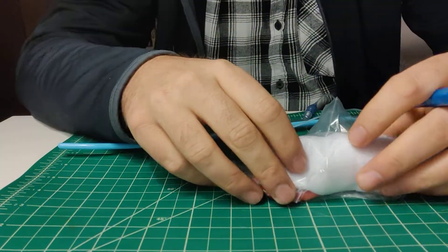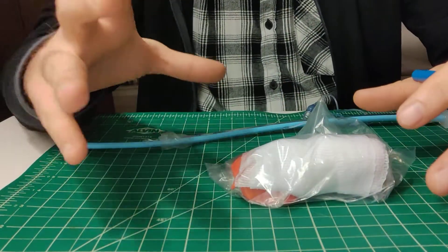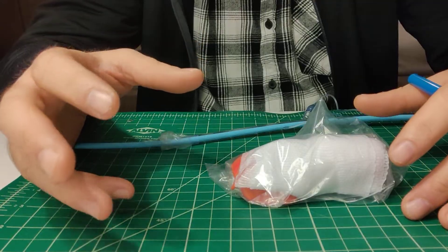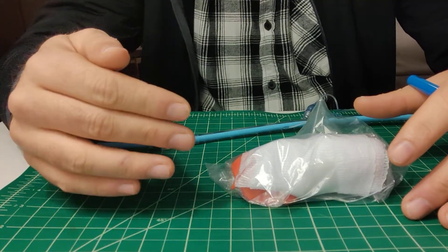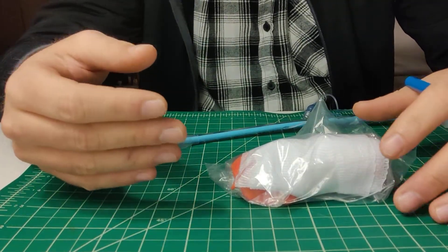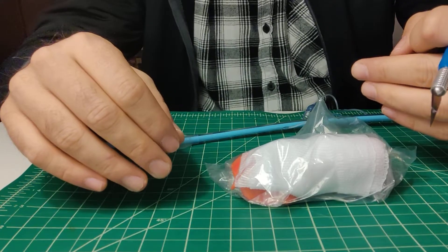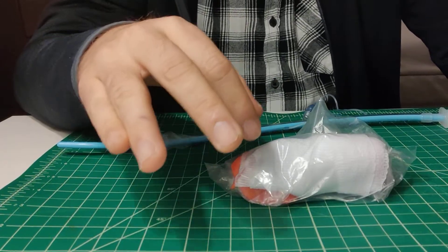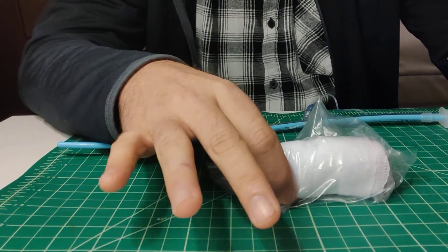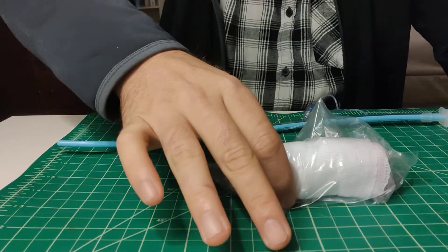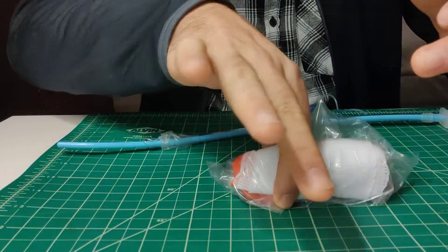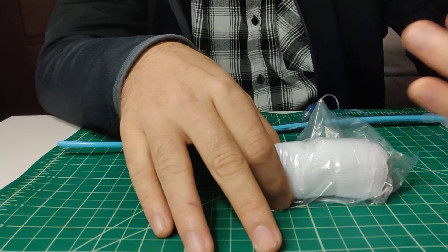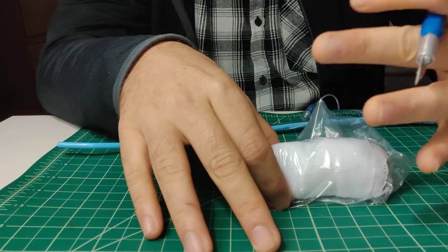All right. So here's how you do this. You always stand on the side of the patient that is your dominant hand. So if you're right-handed you stand on the right side of the bed. If you're left-handed like me, you stand on the left side of the bed. And the reason for that is that your non-dominant hand is going to be stabilizing the cartilage superior to the cricothyroid where the patient's head is right here while your dominant hand is working below doing the incision and the work.